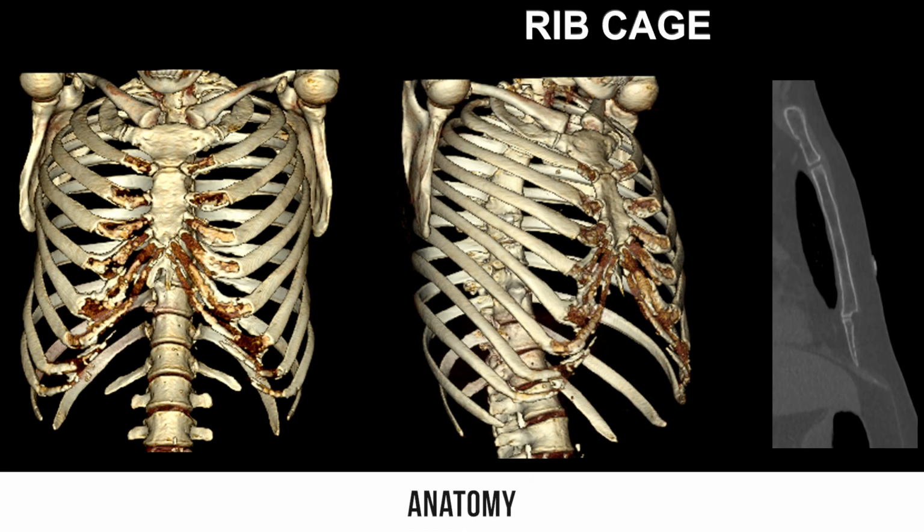We will now see how we perform an ultrasound of the anterior wall of the trunk. We will examine in sequence the thoracic wall, focusing in particular on the pectoralis major muscle, the pectoralis minor, the serratus anterior, and the intercostal muscles. Then we will move on to the abdominal wall with the rectus abdominis and the three superimposed anterior lateral muscles, the transversus abdominis, the internal oblique, and the external oblique. Let's begin right away with the anterior thoracic wall.